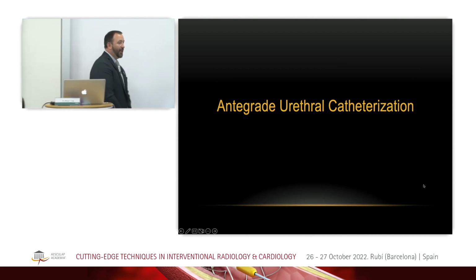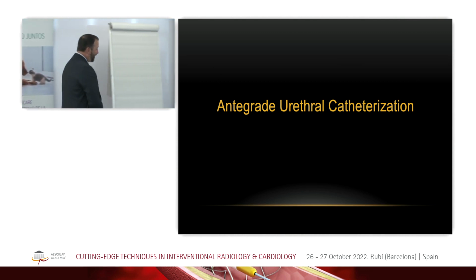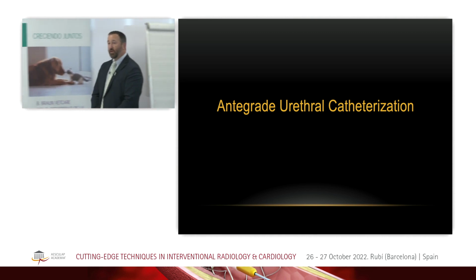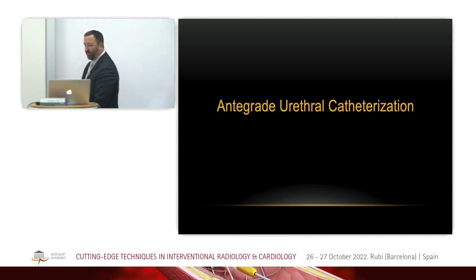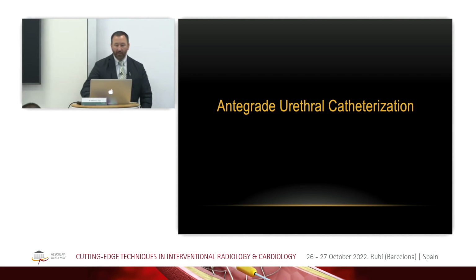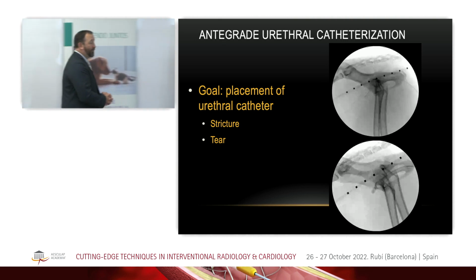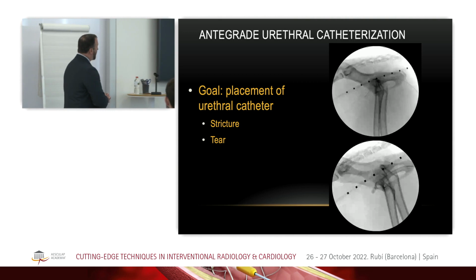All right. Also want to talk about antegrade urethral catheterization. I hope maybe this is one that has a little bit more of an immediate application for you all. This is one that we use very commonly, especially in our ER. Our ER doctors will use this technique. But it's this concept of getting a urethral catheter in a case that's really challenging to get a urethral catheter in. So we'll use this for cats very commonly.